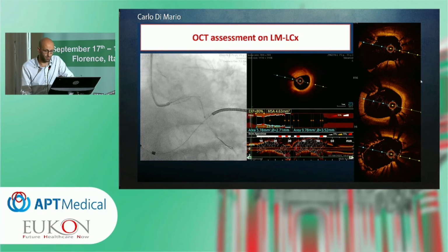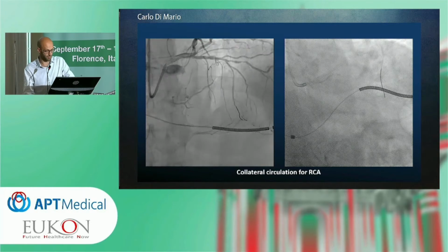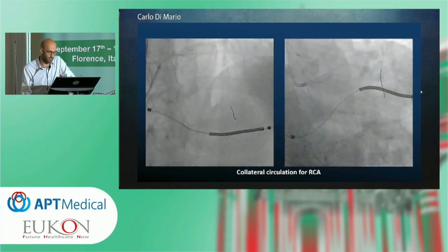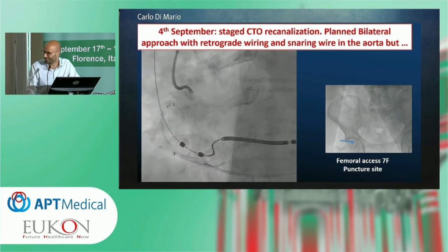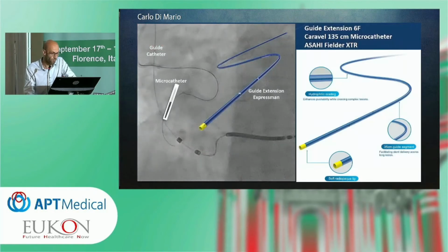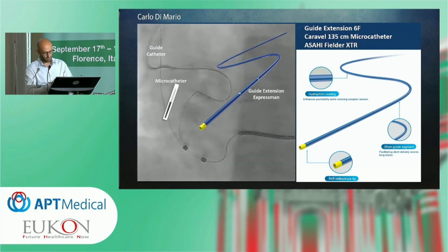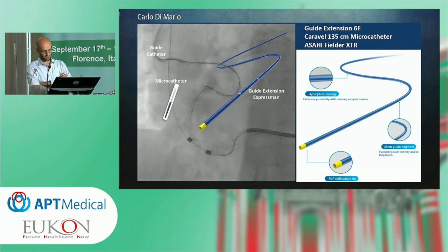So we were planning to complete the revascularization, now trying to cannulate the right ostium from these collaterals. As you can see, this was not a real total occlusion. There was at least some antegrade flow. We were able to advance, you will see, a wire, but the point is that no catheter was able to correctly direct toward the ostium, and so was jumping out of the coronary.